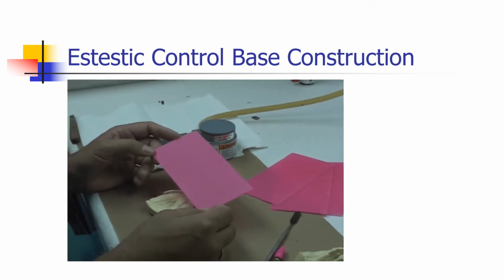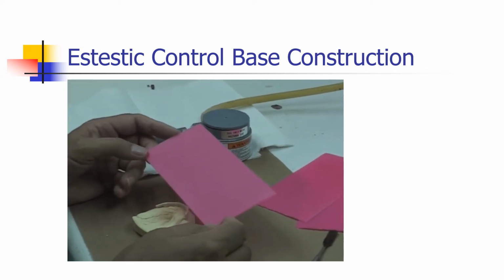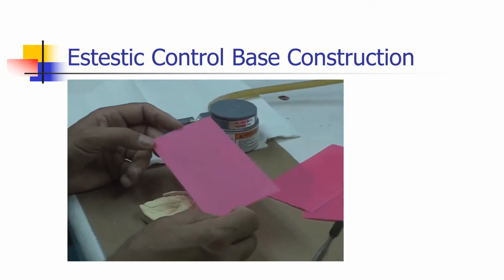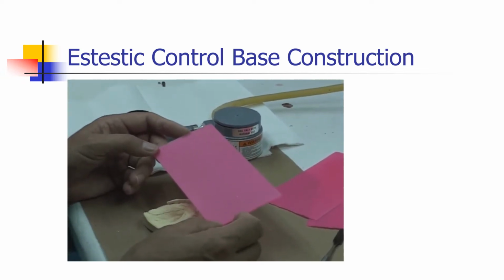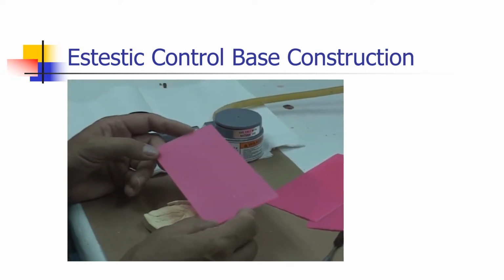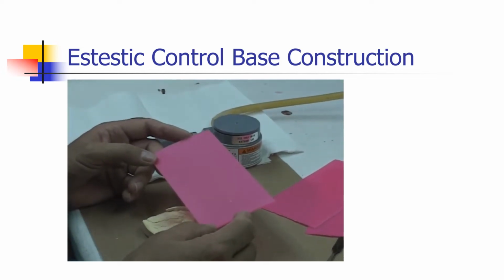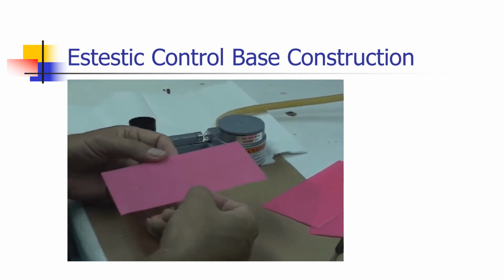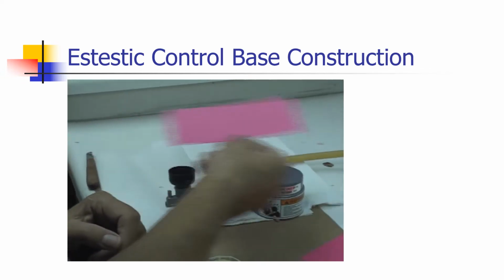And the wax that we use is Modern Material Sure Wax. This material is very nice to work with. It's stable. When we get the teeth set up on, it's very easy to move the teeth around. It doesn't flake or disintegrate when you warm it up to move teeth around. I've been using this wax for many years. We're going to warm it up.